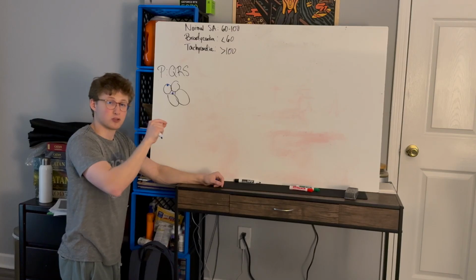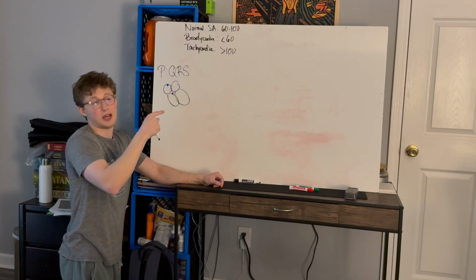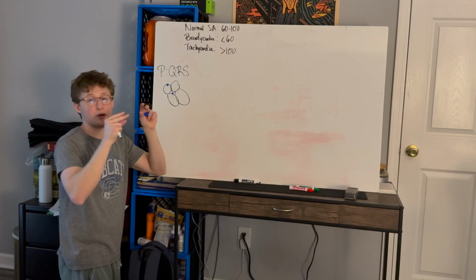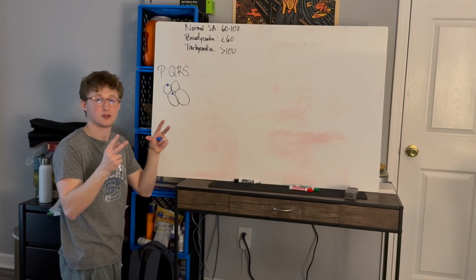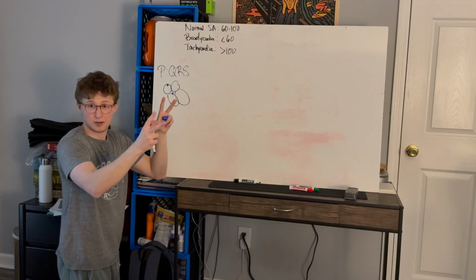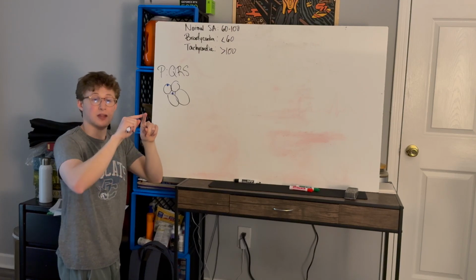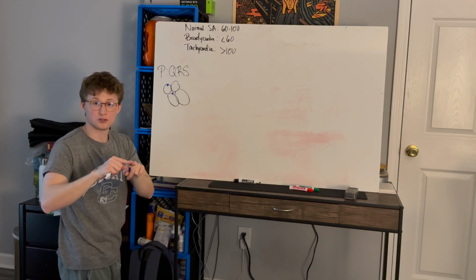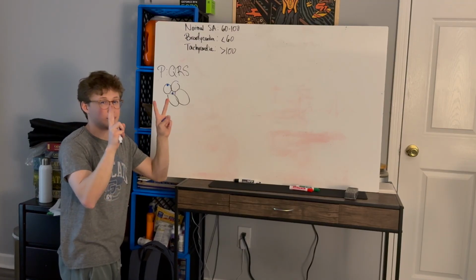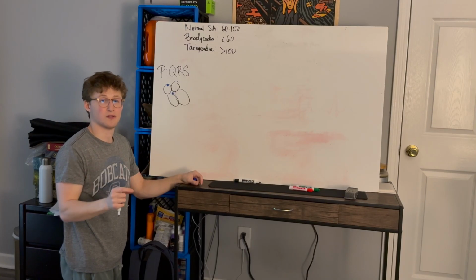So we can get multiple of them for every QRS complex, because in atrial fibrillation we have a bunch of impulses coming from around the atria, creating very weak contractions because it's not a coordinated contraction. So let's say 5 of those happen, and then 1 of them is strong enough to actually get to the AV node, and then cause the AV node to send it down to the ventricles, depolarize, QRS complex. So we just had 5 P waves, and then finally 1 was strong enough to get to the AV node through into the ventricles.